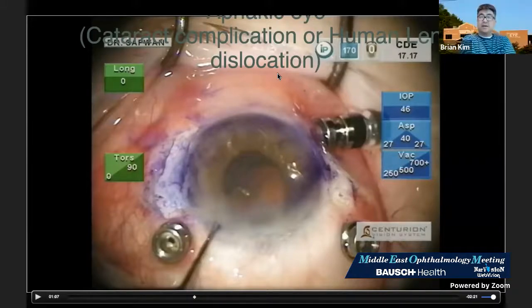What is your opinion regarding the four-flange technique, very briefly? Yeah, I think it's great. The popularization of using 5-0 Prolene to create a flange and passing it around, lassoing around the lens and haptics is excellent. I've been a fan of using Gore-Tex to secure lenses for repositioning, but I think using the 5-0 Prolene to do the same thing without conjunctival dissection is basically like Yamane, but instead of the haptic, you're using suture. The criticism has always been with polypropylene that it breaks, but with the 5-0 Prolene, you can create a flange just the same. Very efficient. So I'm looking forward to trying it, but I haven't done it yet.